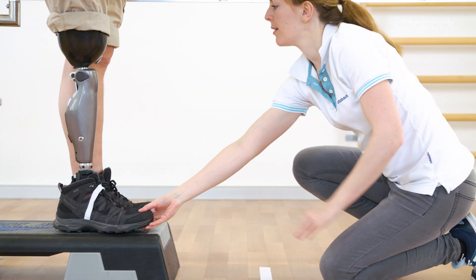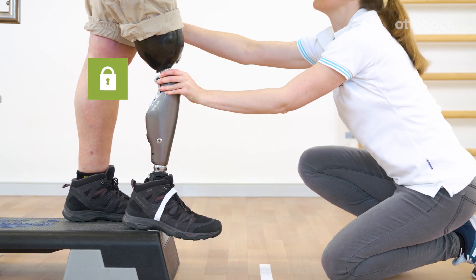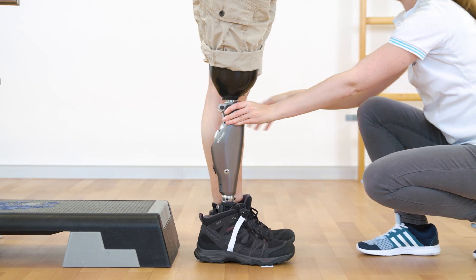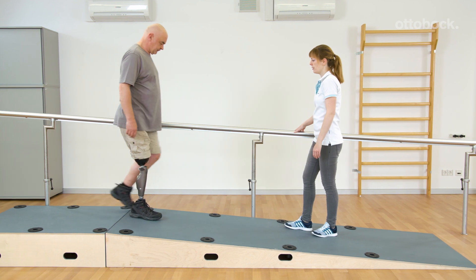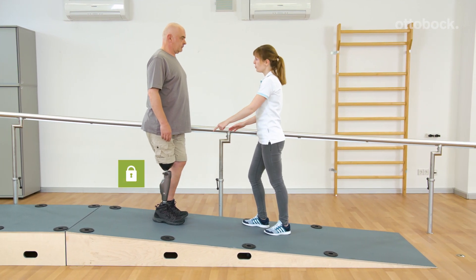Franziska guides the knee into slight flexion so that Gerhard feels he has to allow knee flexion. The center of mass shifts forward. The exercises for activating and deactivating the stance function are then repeated on the shallow slope.